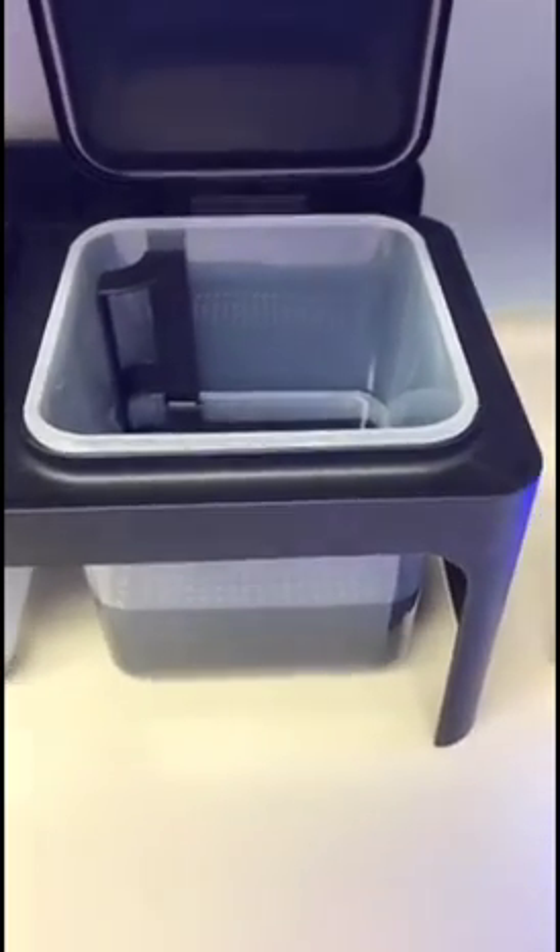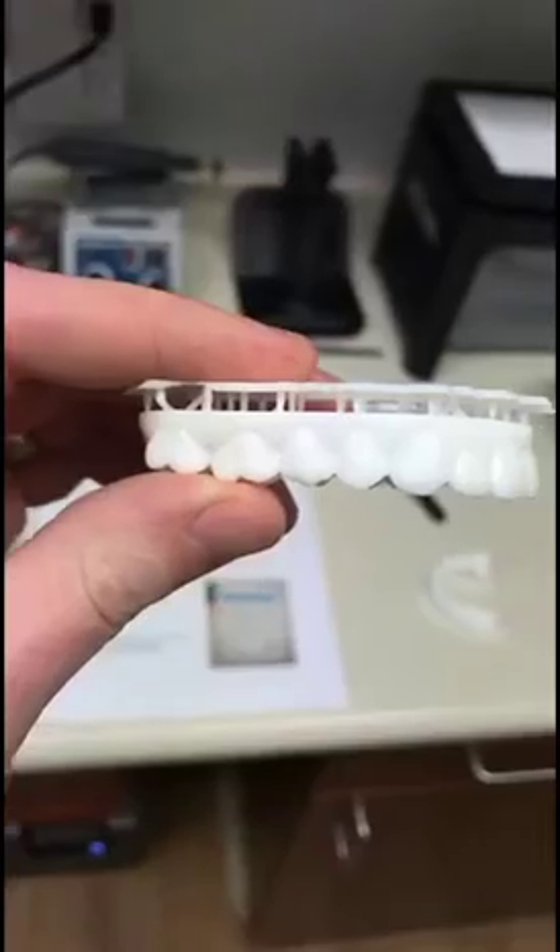The models soak in alcohol for about 20 minutes to clean off, and then they go into a UV curing box, which I've got to be honest, sort of looks like a dance club.